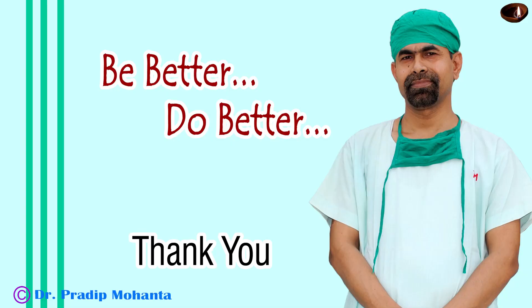Thank you very much for your attention. Hope this video will help you in developing your surgical skills. Please learn pre-chopping. This is very important — don't use unnecessary ultrasonic energy in soft cataracts. Surgery is much safer and much quicker with the use of pre-chopper or nucleus cutter.